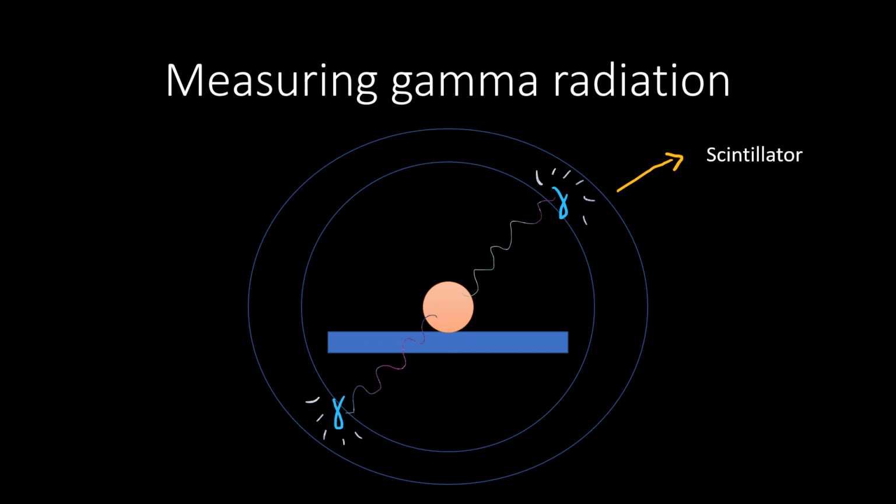A commonly used detector is the photomultiplier tubes, also known as PMTs. It is a vacuum tube where the incoming light photons produce electrons that are accelerated and amplified. This creates an electrical current, which again is proportional to the amount of photons. And this information is used to create the images.